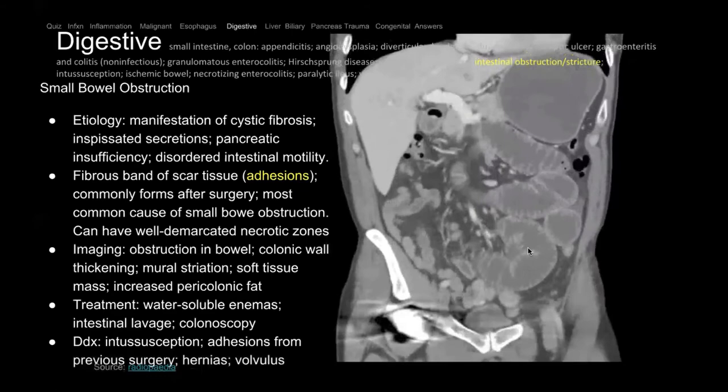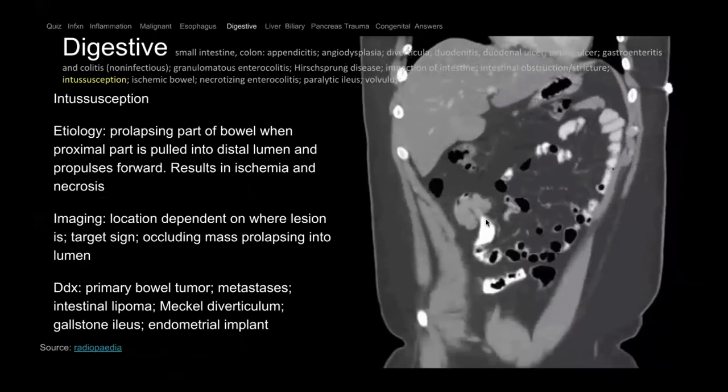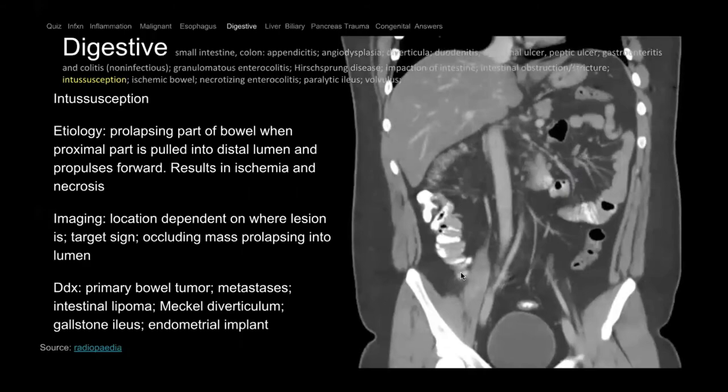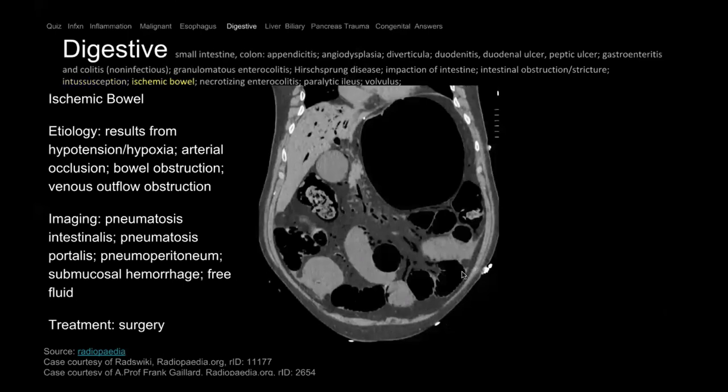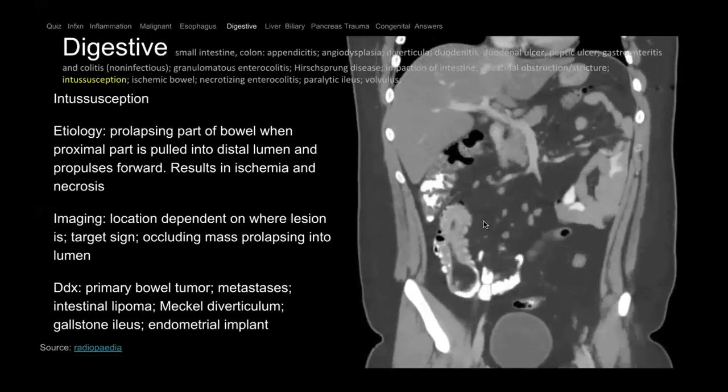Intussusception is when you have telescoping of bowel into bowel. Here we have a bowel going into the bowel with a dark fat-attenuating piece — a lipoma — acting as a lead point for the intussusception. Intussusception can be seen incidentally in children with viral infection, but in adults it's abnormal and you must look for a bowel lesion.